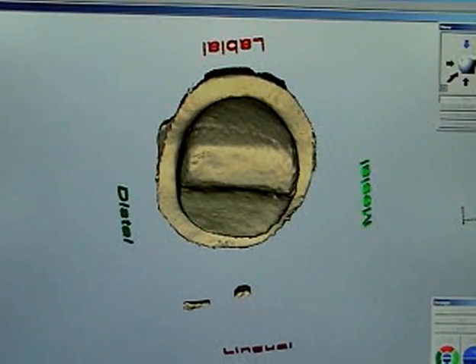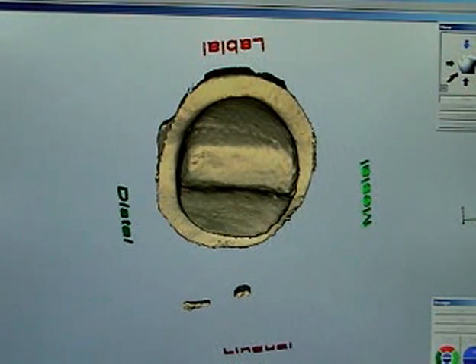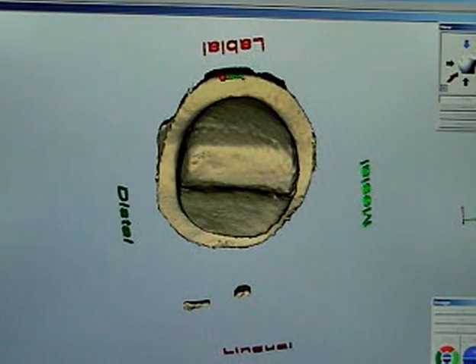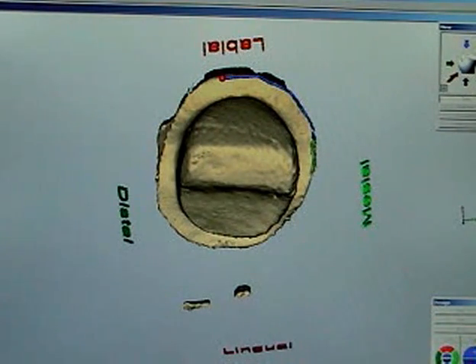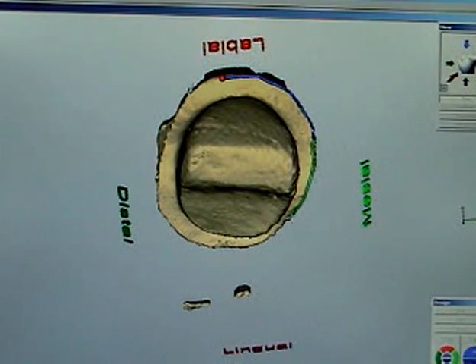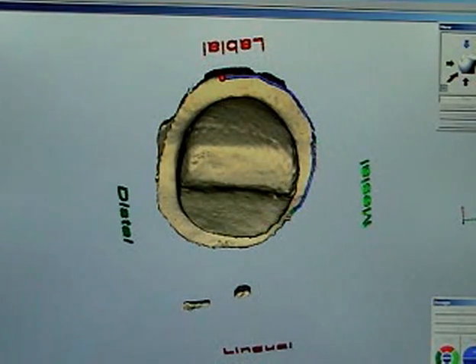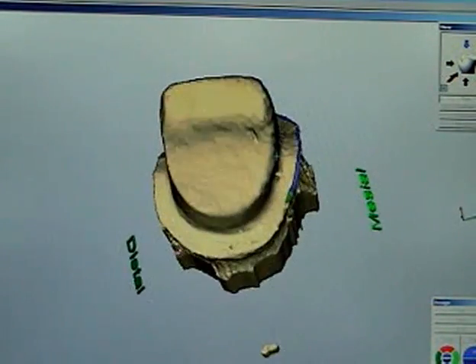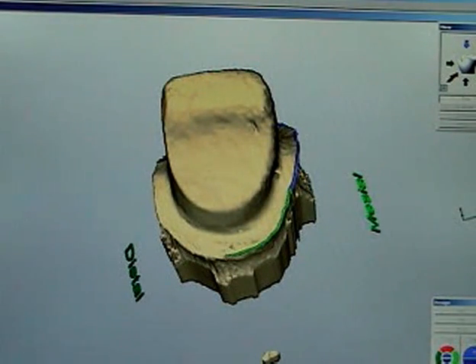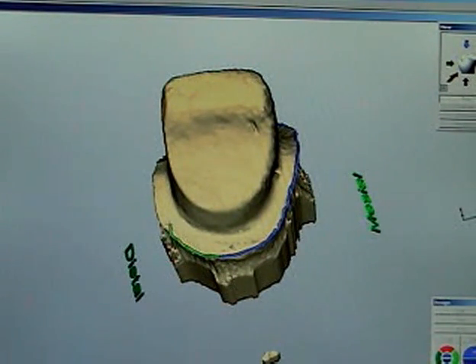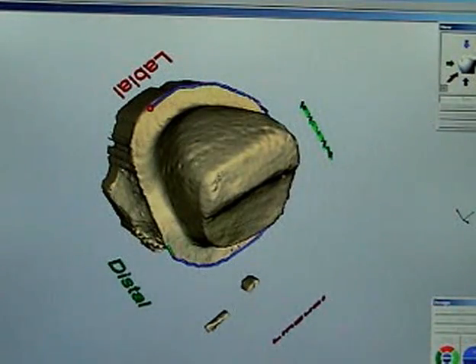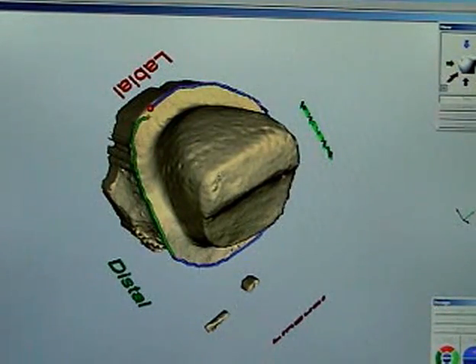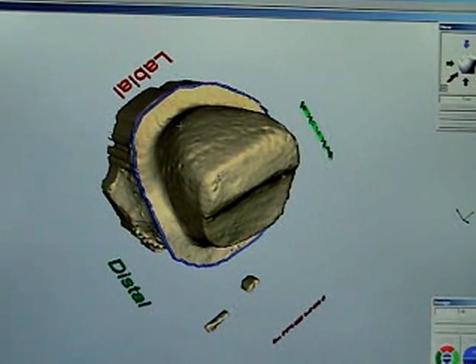So the first stage is to mark the margin of the intended coping. So you should just be able to work out the wiggly worm of the margin going in. You double click to start on the edge of the margin. You can see the red dot. And then it's got an automatic margin finding facility. So it should recognise the margin. Sometimes it gets a bit stuck so we just help it out on its way round. It's quite simple to do this. We're turning the model as we go as well so we can see the margin more clearly.